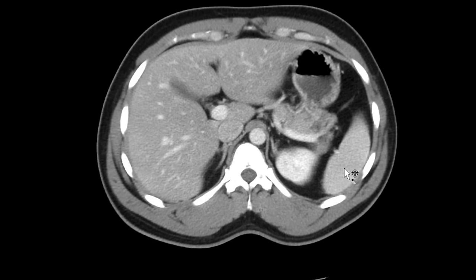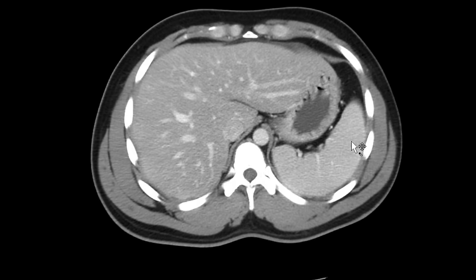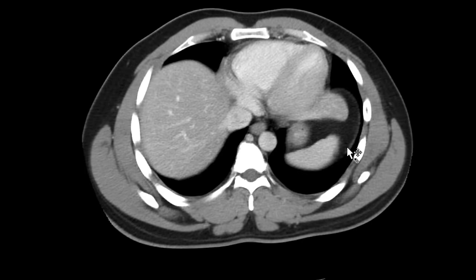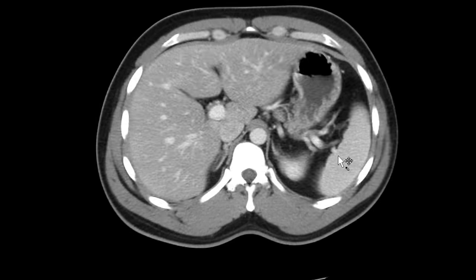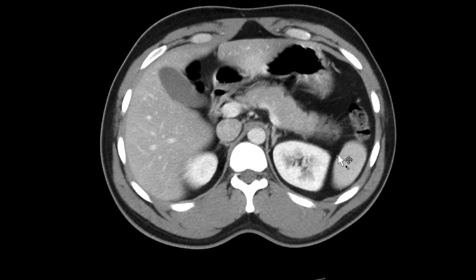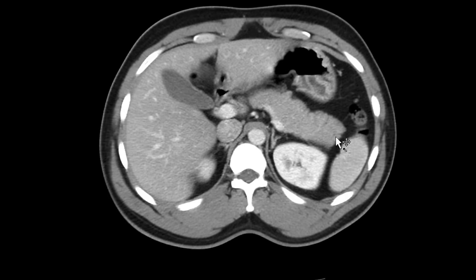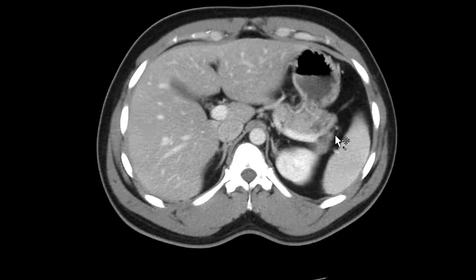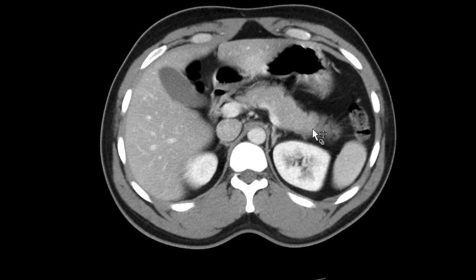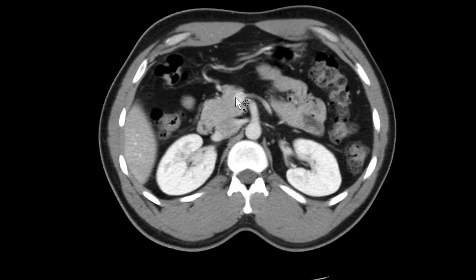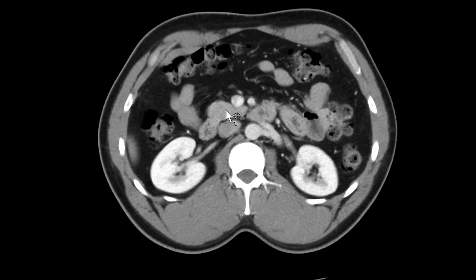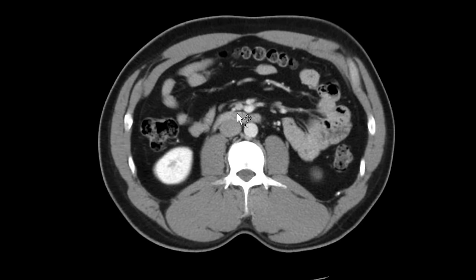Then I check out the spleen. Spleen looks good. While I'm over here I'll go from the distal pancreatic tail, followed along the body, the head, and the uncinate process.